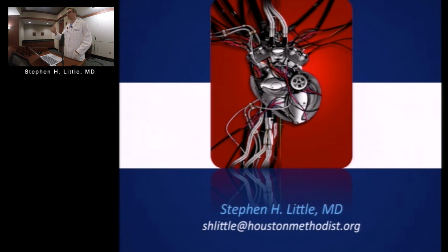If you had the same anatomy and you can 3D print the anatomy, you can pretty closely approximate the hemodynamic conditions, at least the pressure gradient, and say, if I always put the clip here, will I always get the MR here? And maybe the question, if it's feasible and you could do it in a few select cases, is do the entire procedure on a benchtop first and say, okay, if I do this, this, and this, we should have no MR. We're not there yet.